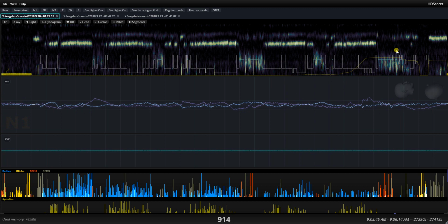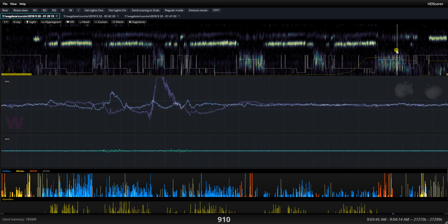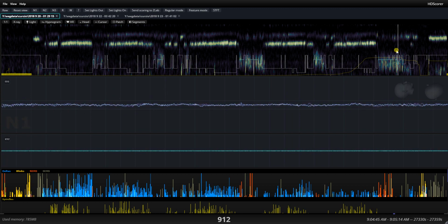Something I'd be a little bit more curious is to go into this chunk that got marked as N1 and figure out if it really is N1, or if some eye movements got missed by the algorithm, which in fact is the case here. So I would set this one and this one as REM as well. But these are minute details, you see. I changed 4 epochs up to this point. And this might actually be N1. I don't see any evidence of anything.